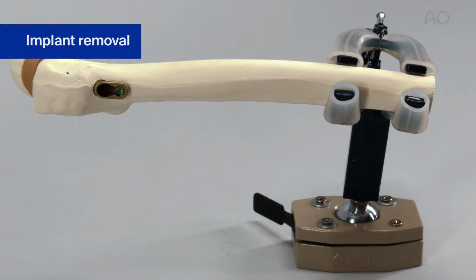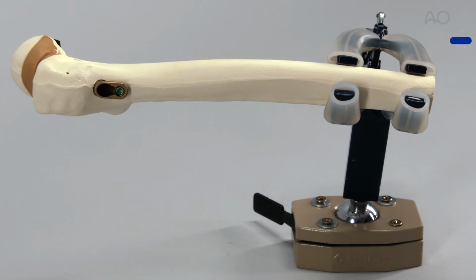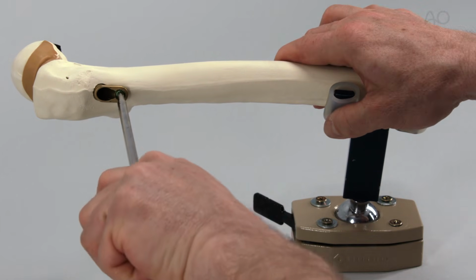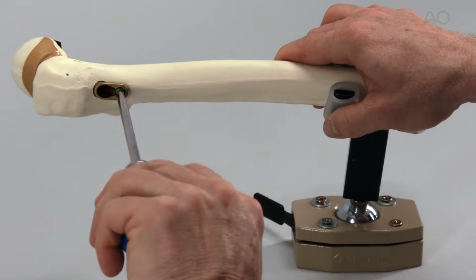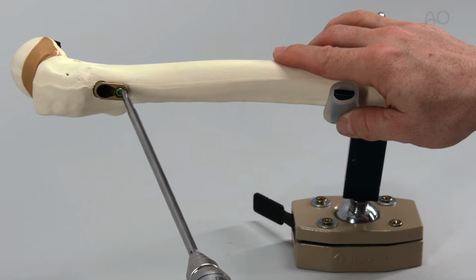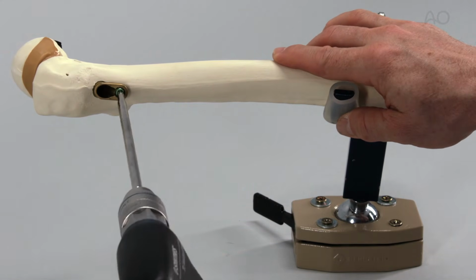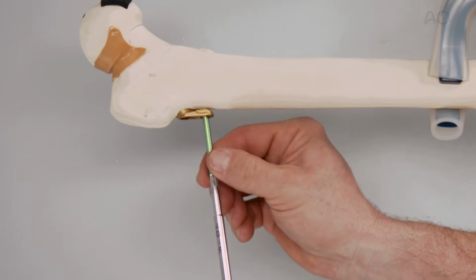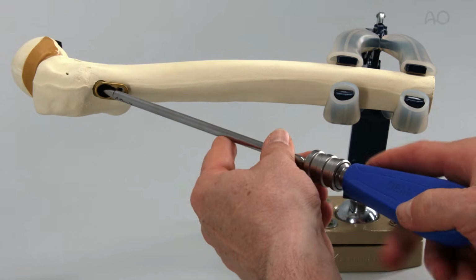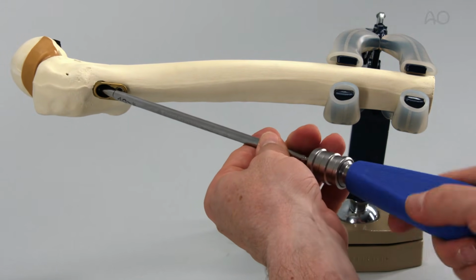To remove the FNS implant, the star drive screwdriver T25 without torque limiter is attached to the large handle. The assembly is used to remove the locking screw and the anti-rotation screw. The screwdriver is turned counterclockwise to initially loosen the locking screw. The screwdriver is then turned counterclockwise to loosen and remove the anti-rotation screw.